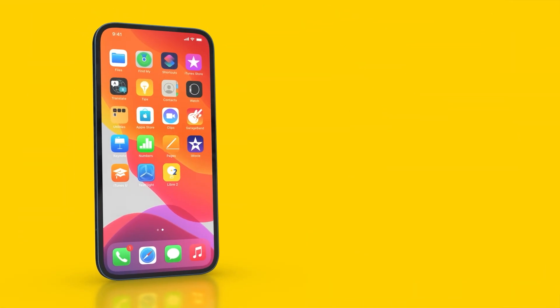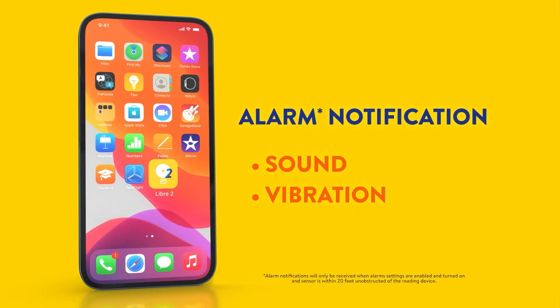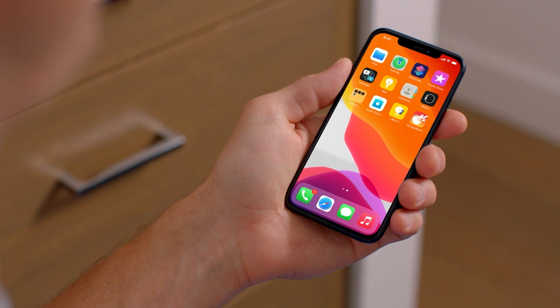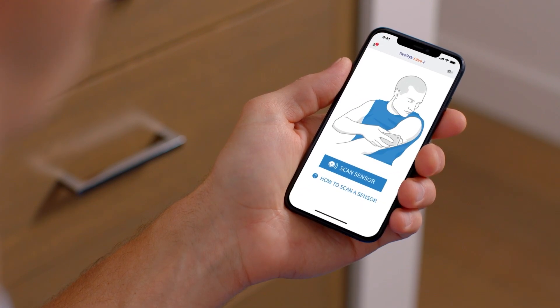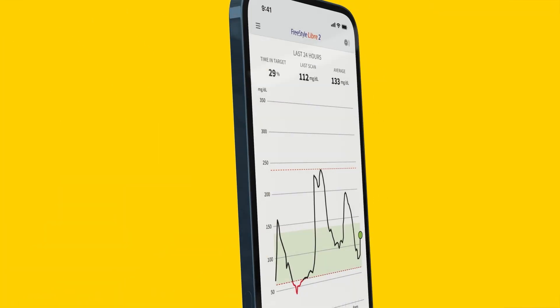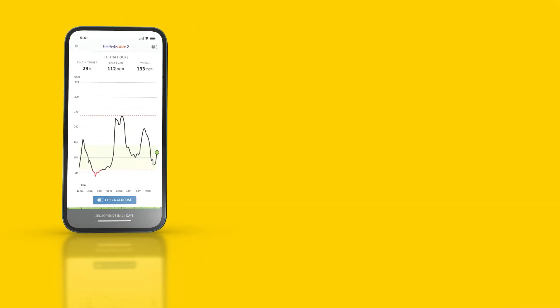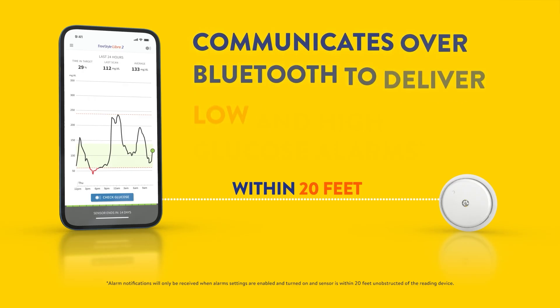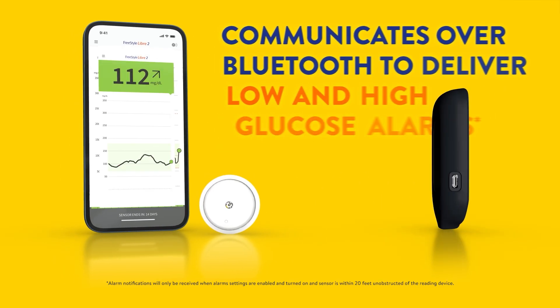The Freestyle Libre 2 app can automatically alarm you with a notification along with a sound or vibration when your glucose has gone above or below the level you set. To get glucose alarms on your phone, you will first need to start your Freestyle Libre 2 sensor with your phone. The app requires that Bluetooth be turned on, and when your phone and sensor are within 20 feet unobstructed, they will automatically communicate over Bluetooth to give you low and high glucose alarms if you have turned alarms on.